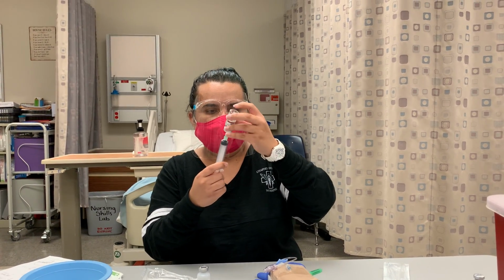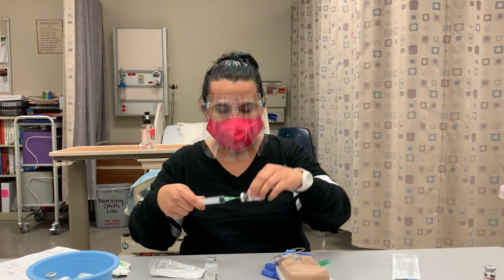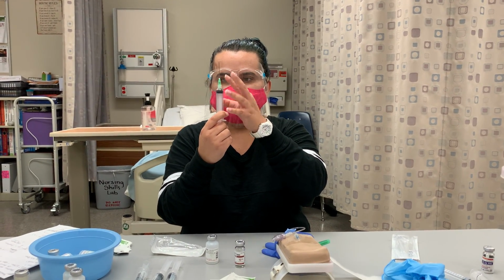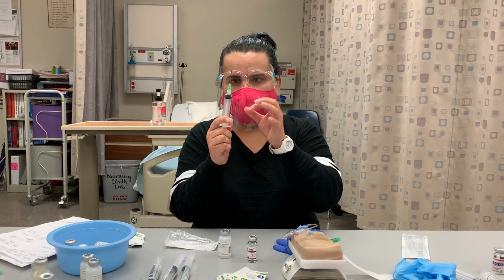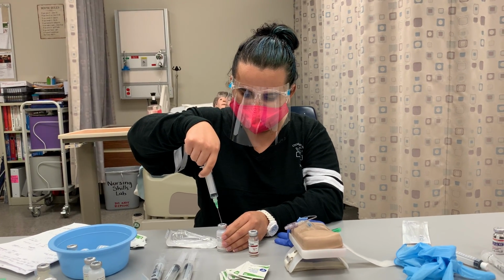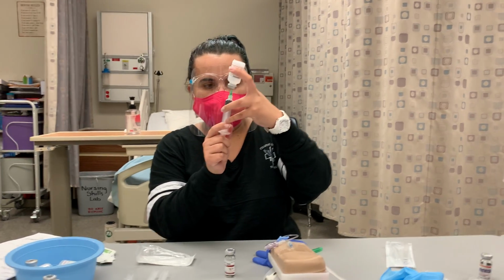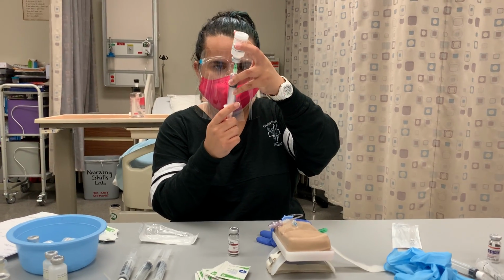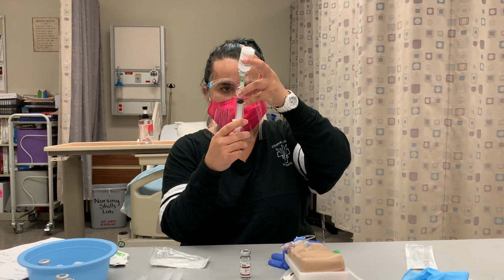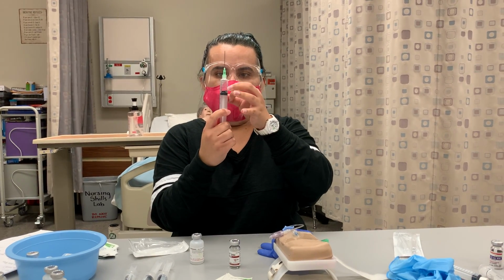Okay, so while I'm here, I want to make sure that I unattach this and make sure that all my bubbles are up. Okay, now I could go ahead and insert my needle into my normal saline and retract all the way to 6 mLs, because that's what my total amount of fluid is. Making sure that I get right at 6. So I'm at 6, could go ahead and remove this and make sure that all bubbles are out.